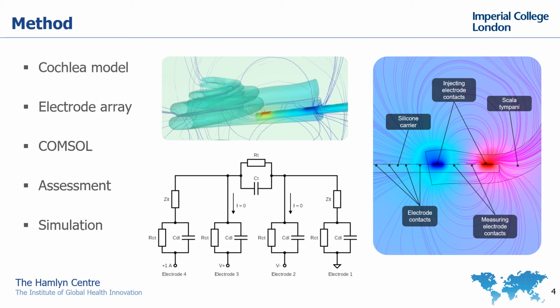For our simulations, we use COMSOL Multiphysics, and in the bottom middle picture we are showing a schematic of the model used. We check reciprocity to assess the validity of our simulation model, and we simulate a spectroscopy impedance measurement at different frequencies.